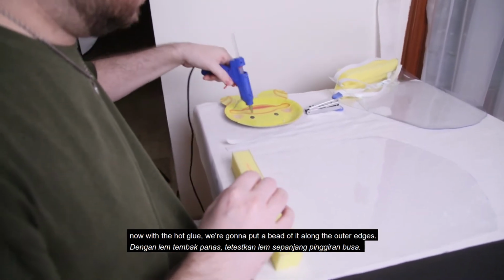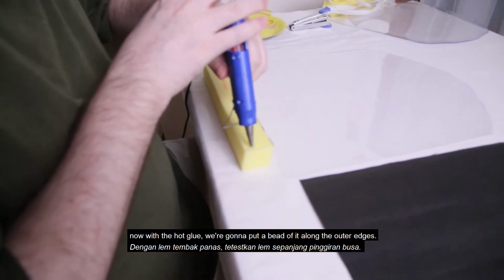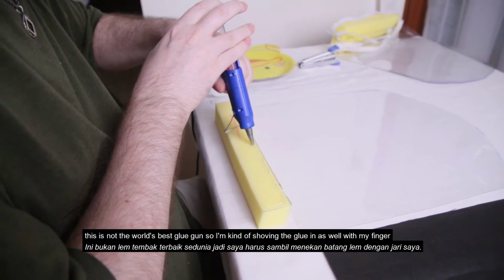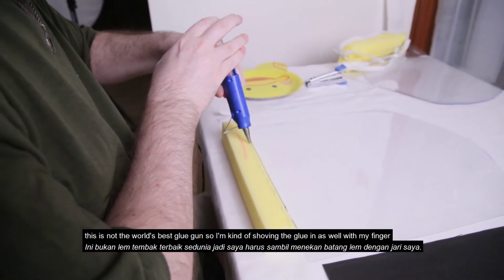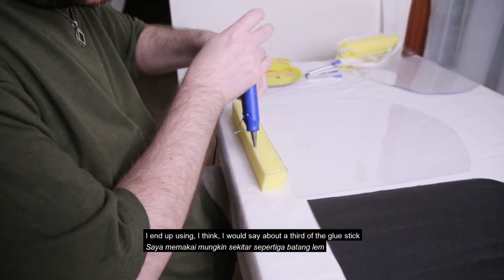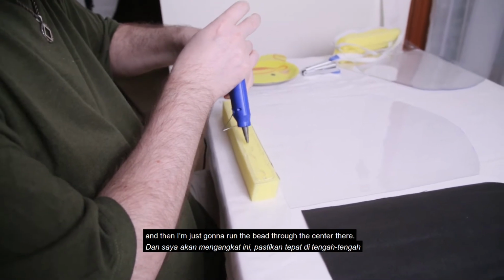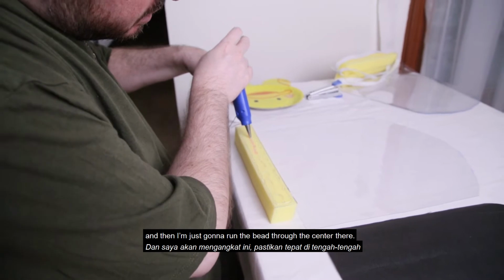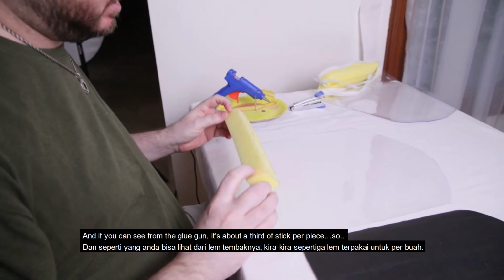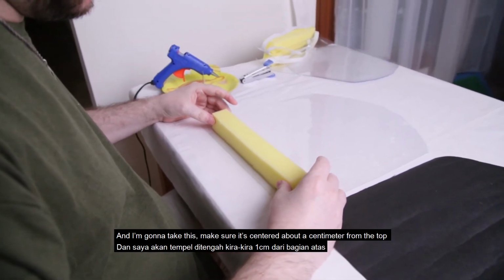Now, with the hot glue, I'm going to put a bead of it along all the outer edges. This is not the world's best glue gun, so I'm kind of shoving the glue in with my finger as well. I end up using about 1/3 of a glue stick per piece, and then I'm just going to run a bead through the center there. And if you can see from the glue gun, it's about 1/3 of a stick per piece. So, I'm going to take this, again, make sure it's centered, and about 1 centimeter from the top.